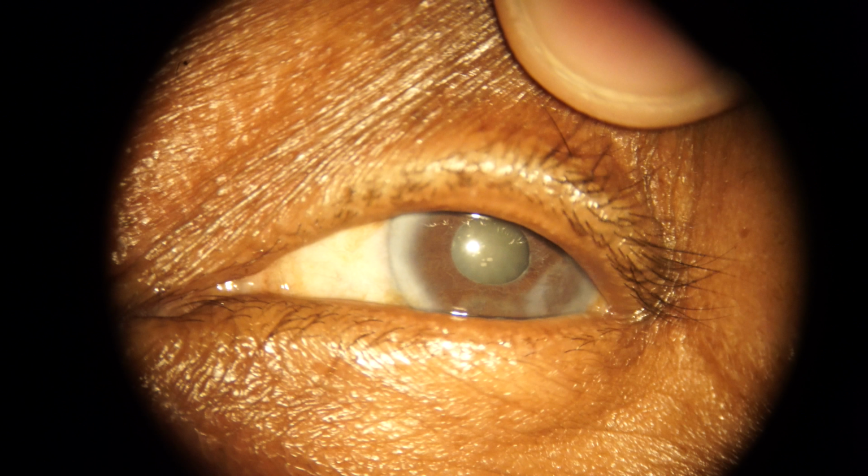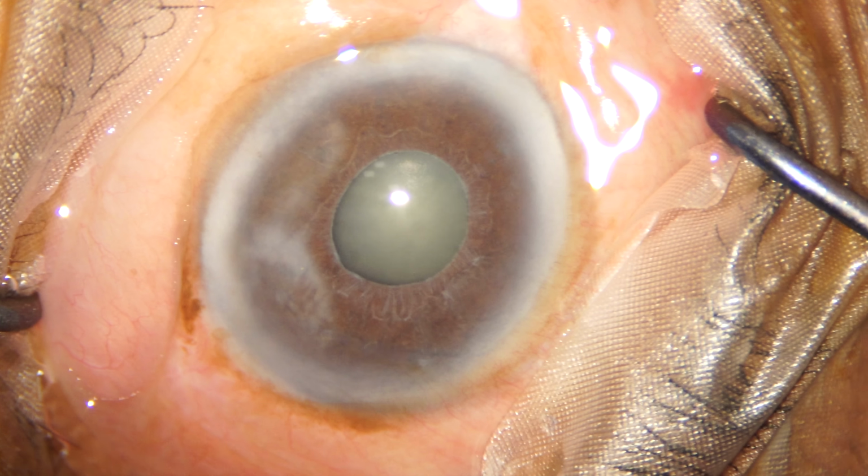This was one of those cases where I was out of my comfort zone. As you can see, this is a very deep-seated eye with a prominent brow, and it was the left eye. Also, it had pseudoexfoliation with a non-dilating pupil and a peripheral corneal opacity. So this was a recipe for many complications.